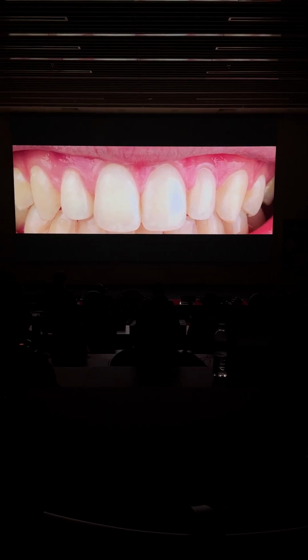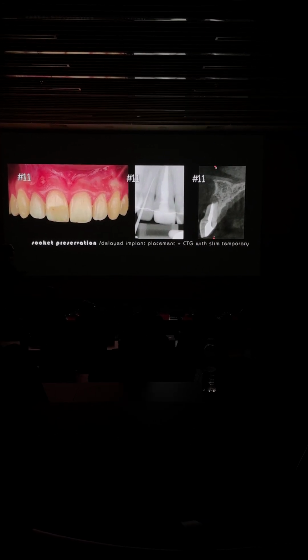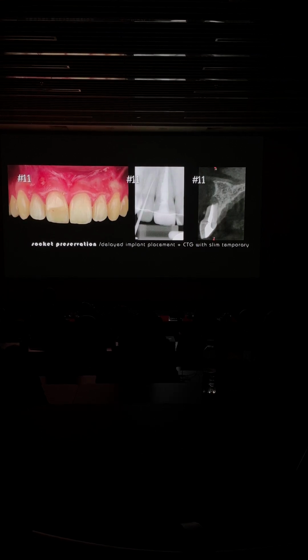So we have many cases, and I would like to share a complex one, especially when you have kids that had an apicoectomy, no buccal bone. Today I would have done an immediate implant placement, as I showed you yesterday, but at that time we were not doing that. And you can see we have a fistula. She's 16 years old, she's in pain, so we did socket preservation technique.